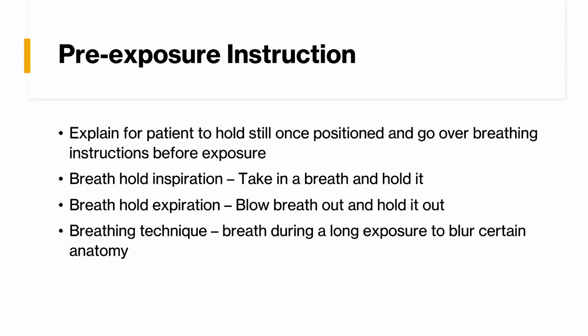If it were the opposite, expiration, sometimes we'll see that with abdominal imaging, because they will have a higher diaphragm, we'll be able to see a little bit more of the abdomen. Sometimes we'll want those for specific chest imaging if we're looking for something a little bit more subtle.